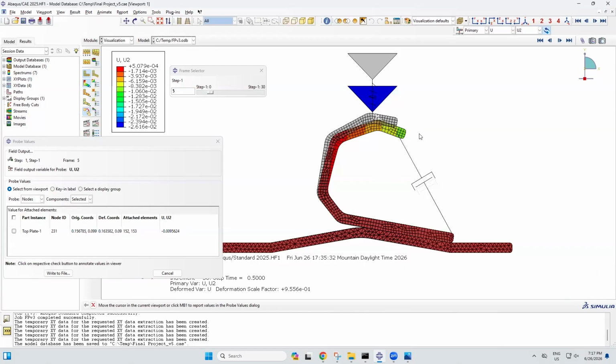At step 5, we are approaching equilibrium with the vertical displacement being 9.5 millimeters downward. As the part returns to equilibrium, the horizontal displacement is getting smaller as well, and we see that with the resulting horizontal displacement of 6.8 millimeters. Step 6 is really affirming the equilibrium position, with a horizontal displacement of 6.8 millimeters. Additionally, the vertical displacement is 9.7 millimeters.